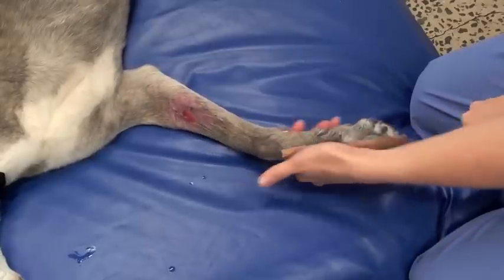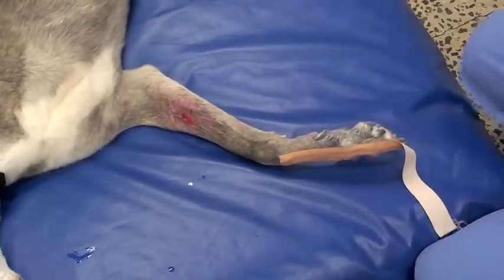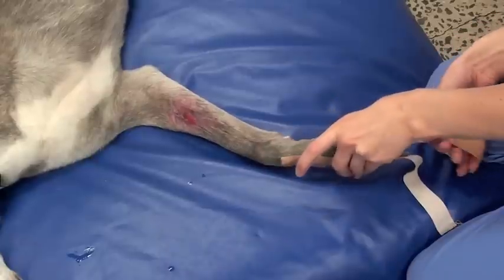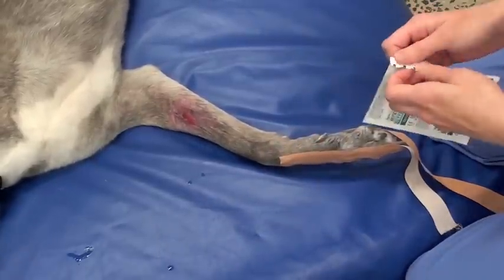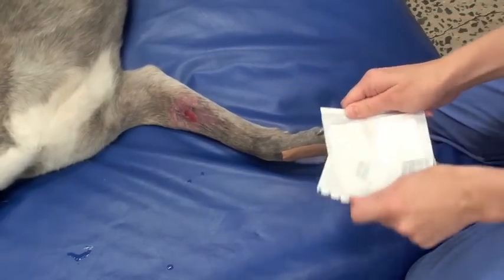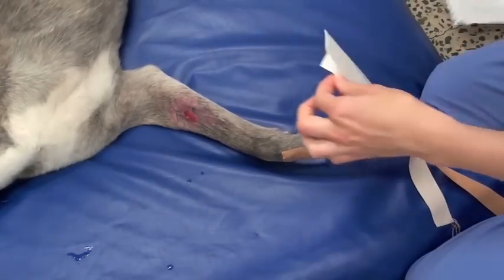The first thing we do is put stirrups on the end of the foot to assure that the bandage doesn't ride up or slide down off the leg. These stirrups are made of just adhesive tape like Leukoplast or something like that.